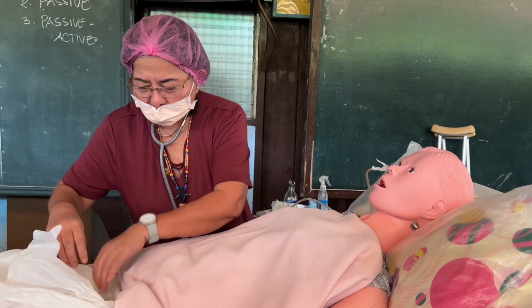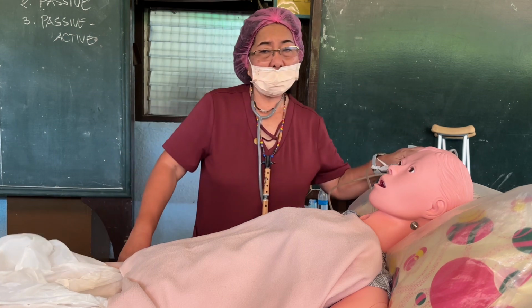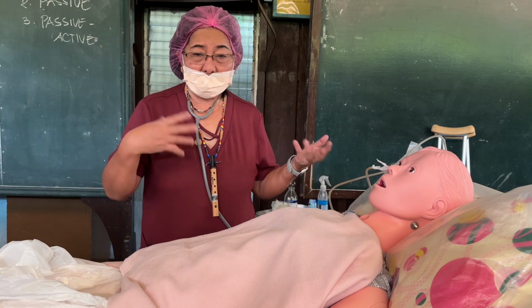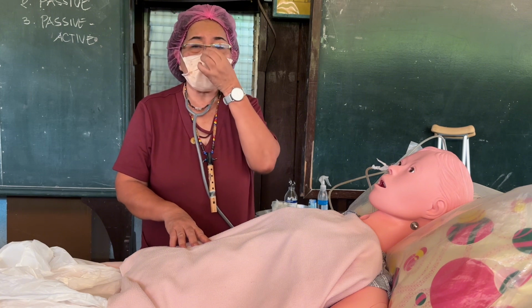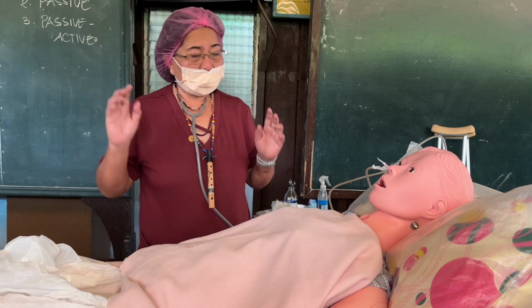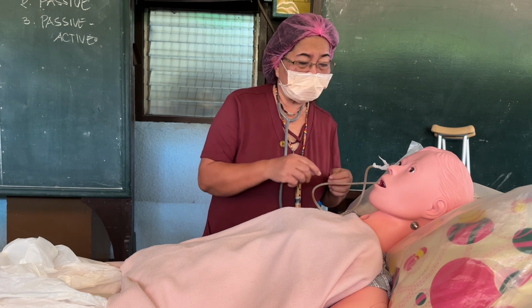Then you instruct your patient, ma'am, at the count of 3, kindly hold your breath. When feeding and especially when removing the tube, wear clean gloves, because you will be handling what comes from inside the body. Clean gloves, okay? Ma'am, at the count of 3, kindly hold your breath.